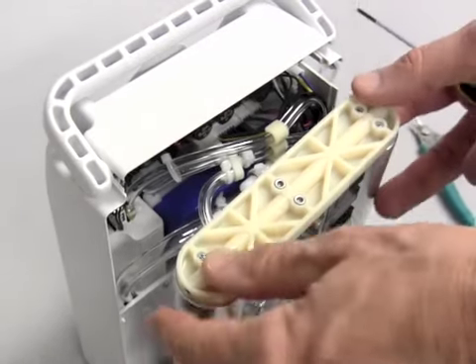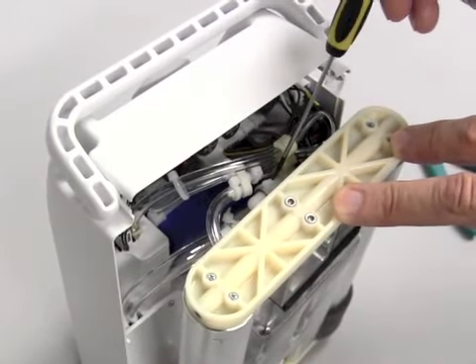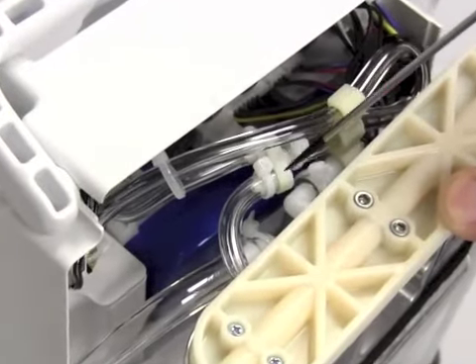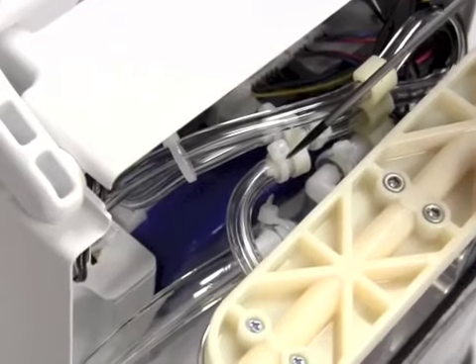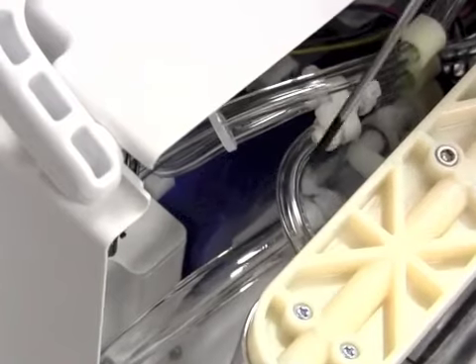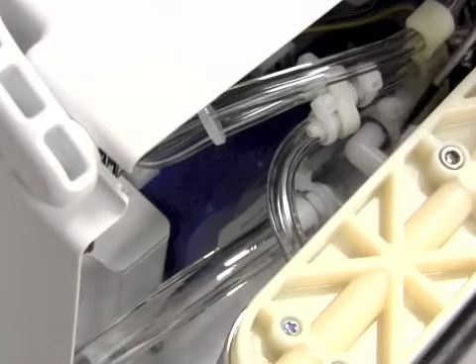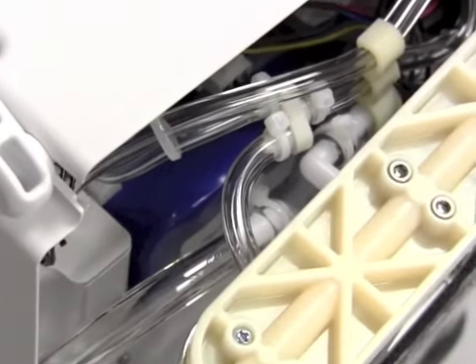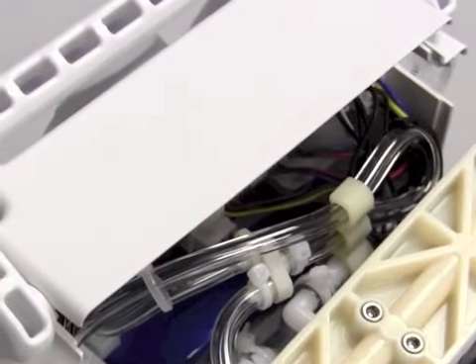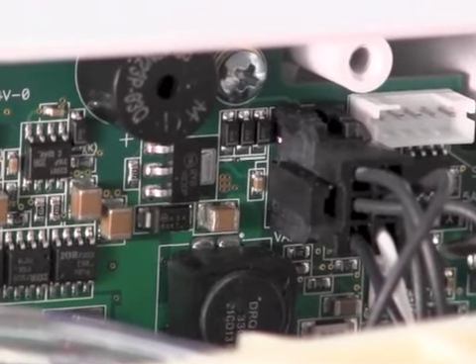Okay, with the sieve bed assembly exposed, our next steps are to remove the Tygon tubing from the sieve bed assembly, and there's 3 tubes that have to be disconnected. This small tubing on top, there's a wire tie that has to be cut, and then there's 2 Tygon tubes that come from the compressor, and the wire ties that hold it to the sieve bed have to be cut, 1 and 2 here. And the last thing that has to be disconnected is the plug from the circuit board. This is the plug that needs to be disconnected from the circuit board.